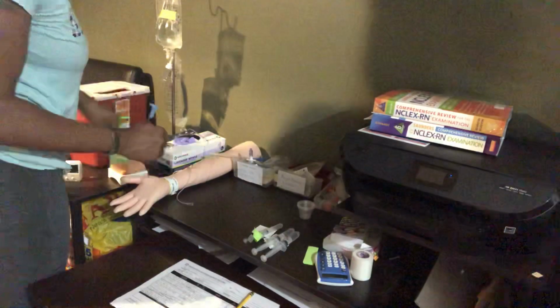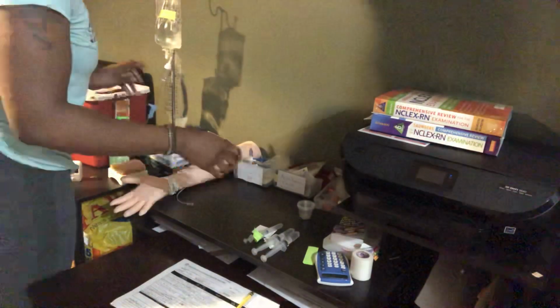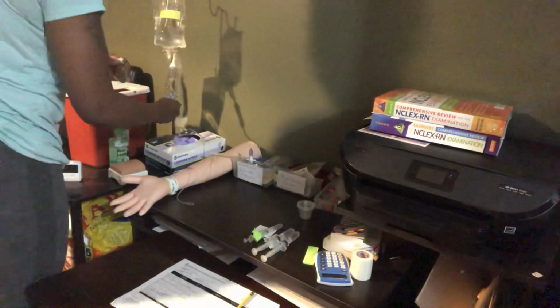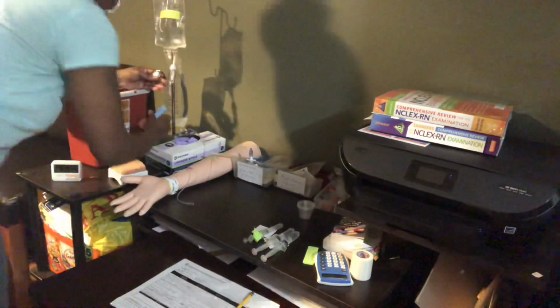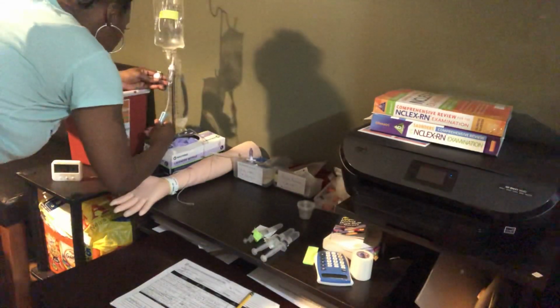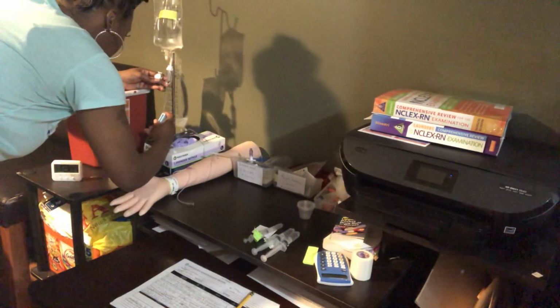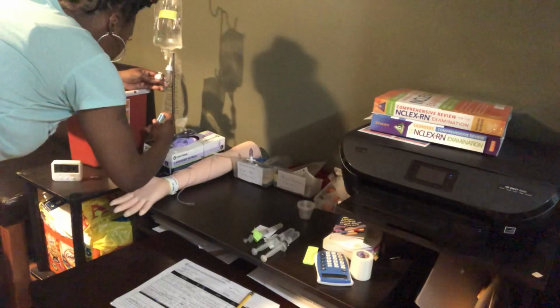So use the lower one to control it. And let's see. Go ahead and get the drops to flowing.